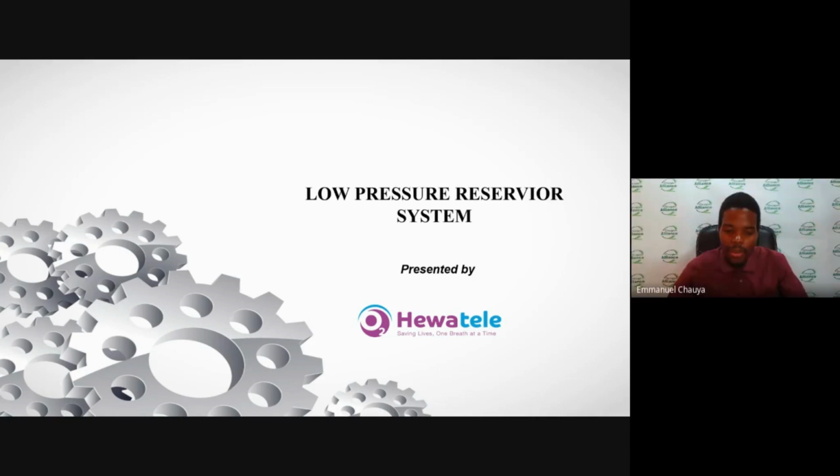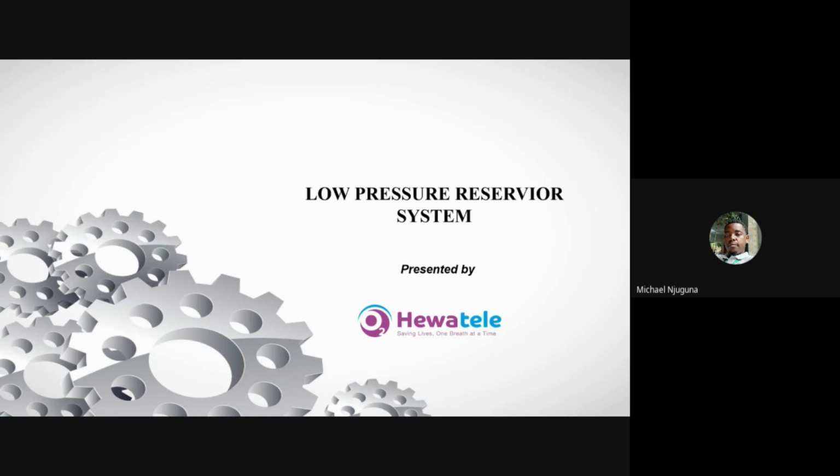All right, Michael, did you get that? Yes, I heard George. Thank you, George, for that question. Of course, our desire is that the filling station should get flow rates from any oxygen source, especially concentrators, at 10 liters per minute. So your approach is more of a creative way to make sure that the reservoir tank gets the adequate amount of oxygen. So yes, I must say that that is also one way you can achieve that.